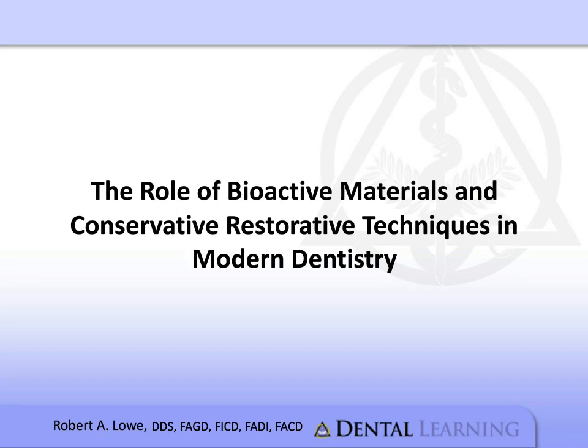Rob Lowe with us tonight to discuss and demonstrate techniques to conservatively prepare and restore teeth using bioactive restorative materials. Cavity liners and restorative materials now have the capability of helping to rebuild and remineralize affected tooth structure and help protect the teeth from acid attack. These bioactive smart materials also offer an interesting restorative option. A conservative approach for both tooth preparation and caries excavation will also be discussed.